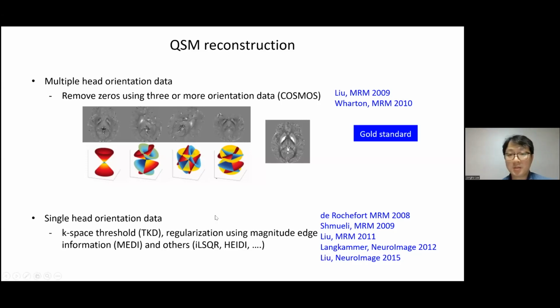This is a technology that allows us to get a gold standard result, but it's not something that's practical. You cannot really have your patient rotate the brain multiple times in a scanner. I often joke that this is something that you can do if you are a graduate student and a co-author of the paper.